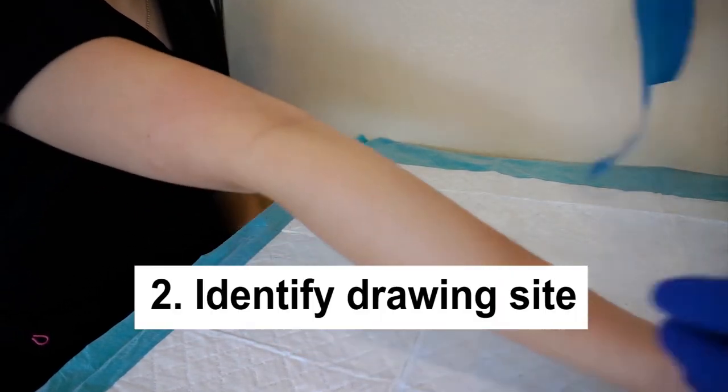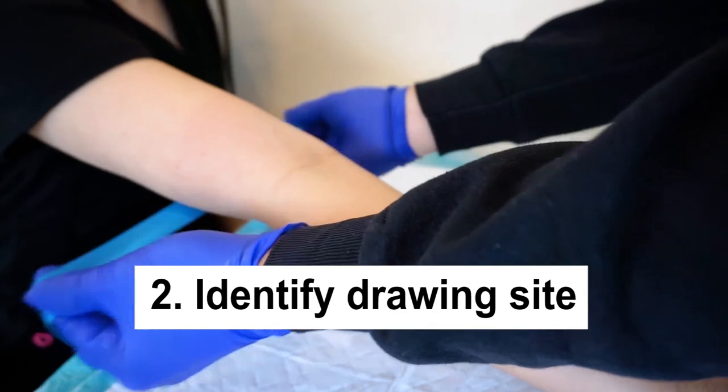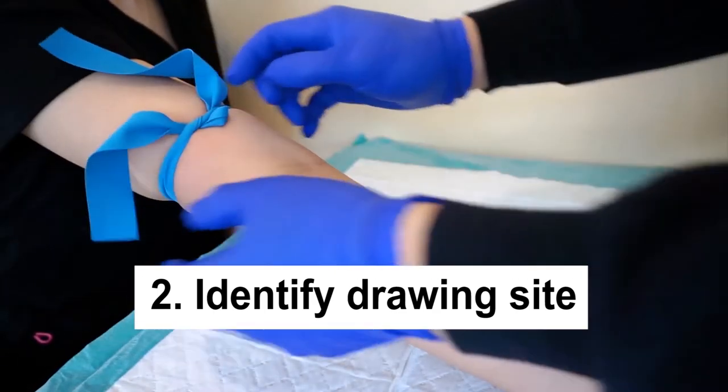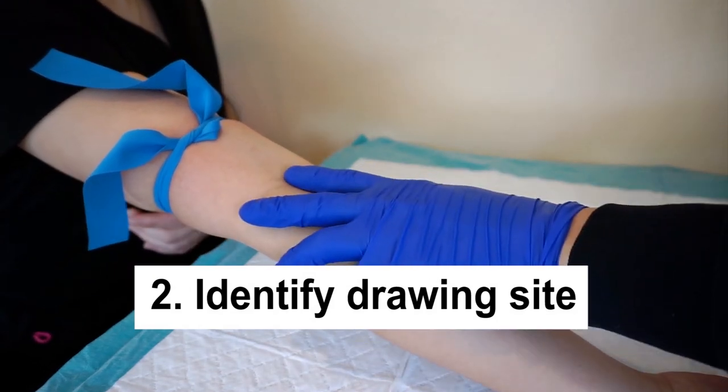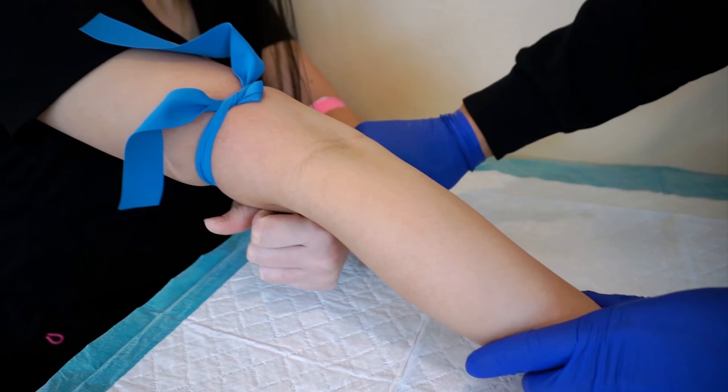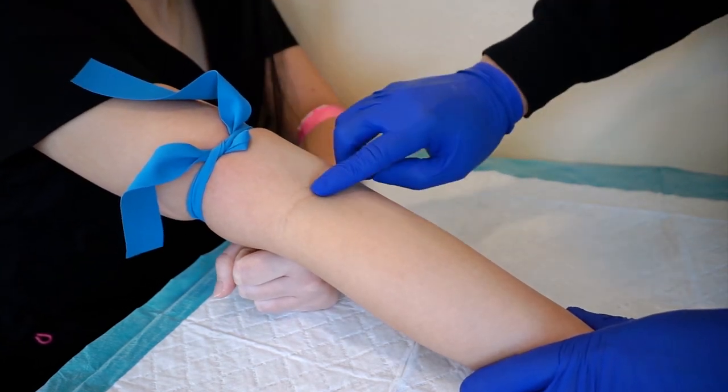Second, identify the drawing site by palpating the patient's vein. Look for a good bouncing vein, not what is visible to the eye. Start looking for the vein from the antecubital site, generally located at the bend of the elbow.